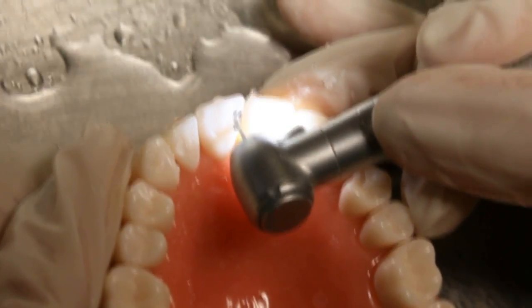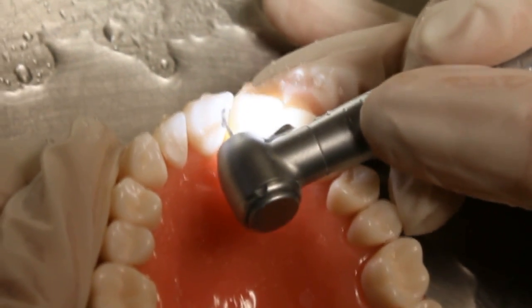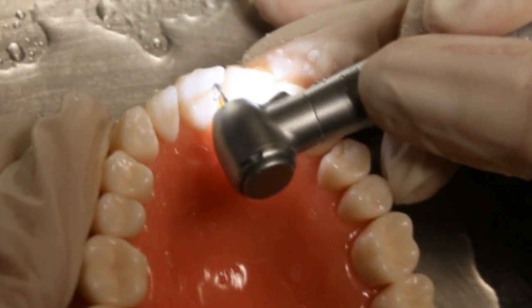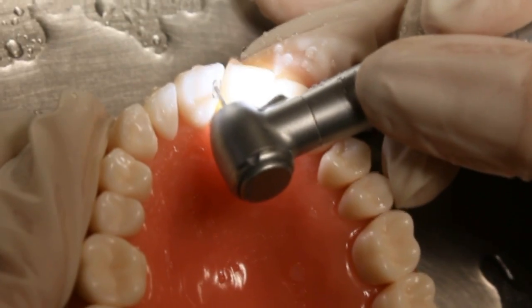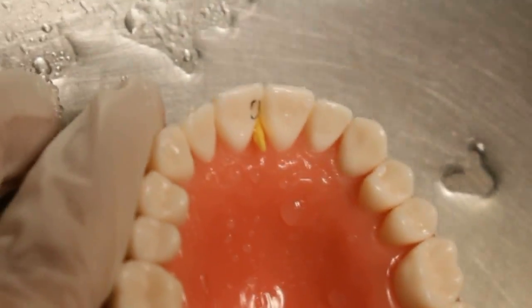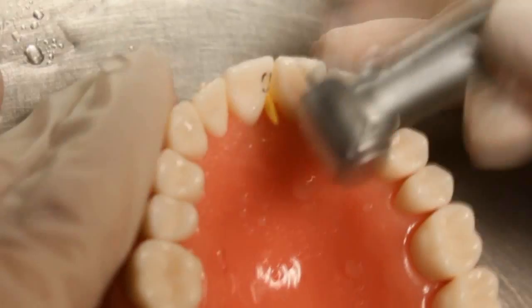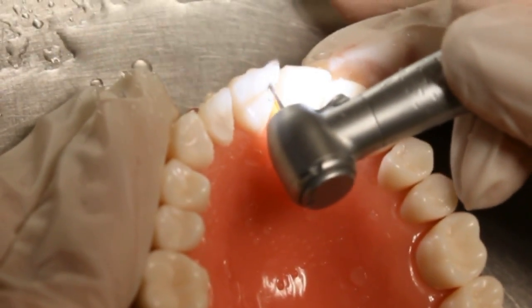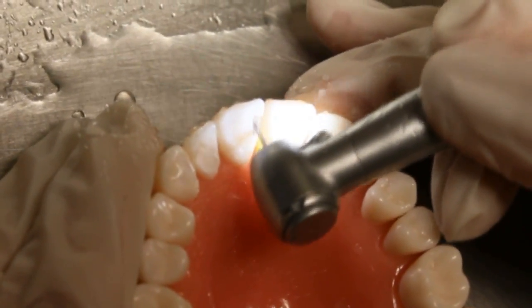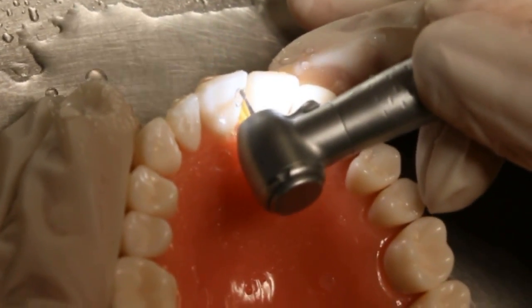Be careful not to damage the adjacent tooth by putting a wedge between the tooth we are working on and the adjacent tooth. If you want more protection, place a matrix. Try to measure what you have done to stay on the safe side and avoid harming the tooth structure by over-drilling. Check if there is any undermining of the structure. The wall should be smooth with no roughness.